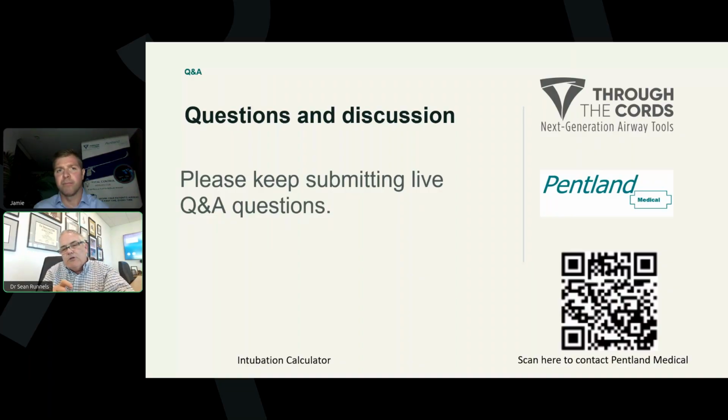But it's one of the challenges with airway management that the catastrophic events, fortunately, are rare. And so how do you know if it's reducing catastrophic events? You have to have such huge numbers that those are very difficult and expensive and long projects to undergo. So we're looking upstream at near misses and seeing if we can lower those.